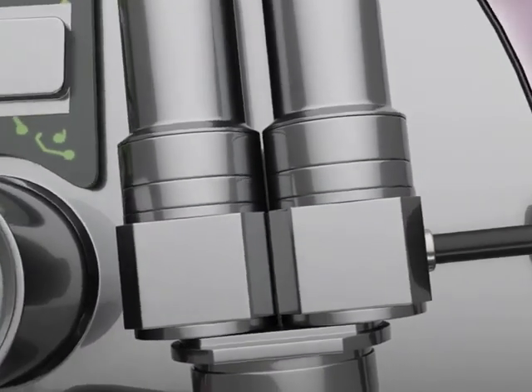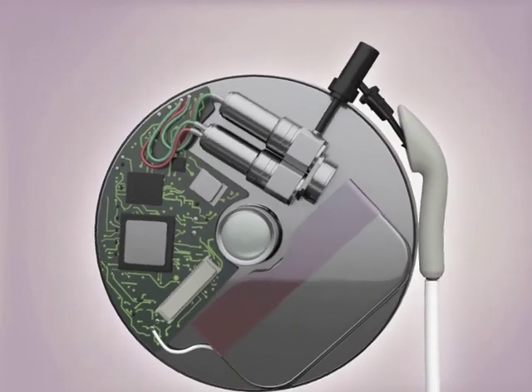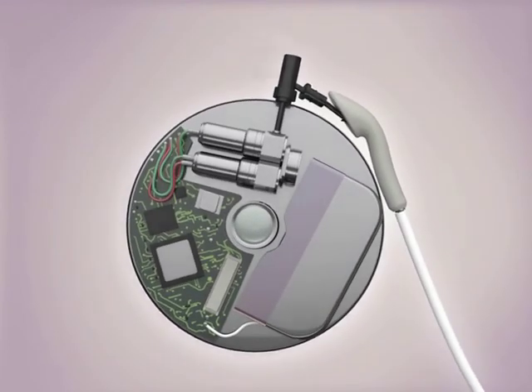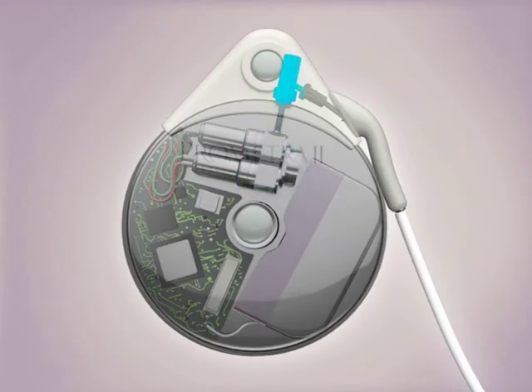After the medication leaves the PDS and FAV, the medication then travels from the pump stem to the catheter, where it will then be delivered to the intrathecal space.